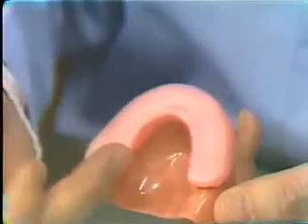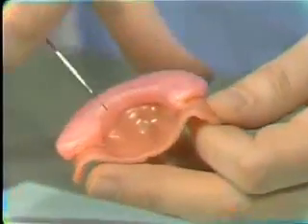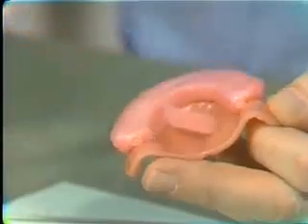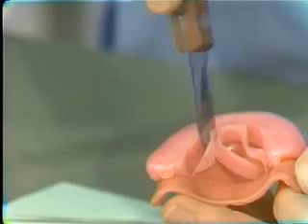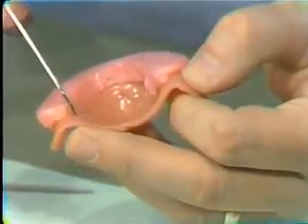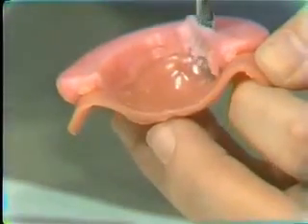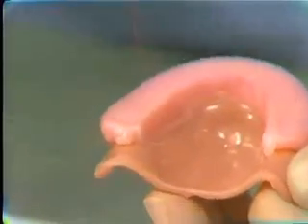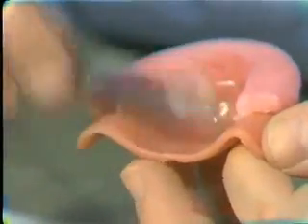But we have some more adjusting to do. One of the things is that we've moved excess wax into the tongue space, so let's remove some of that. So with a hot blade or warm blade on the buffalo knife, don't use the scalpel for this, it doesn't retain heat long enough. Let's remove some of that excess wax, because we're going to be doing more in the mouth with these bite rims, and we don't want the patient's tongue restricted. That gives us false movements of the jaws. And then we can dress up the posterior section a little bit.